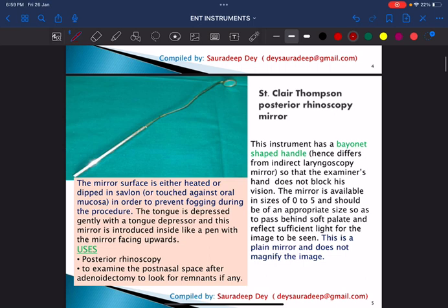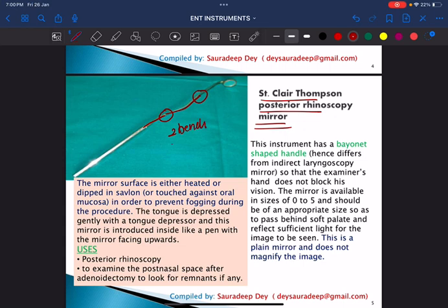Next is the St. Clair Thompson posterior rhinoscopy mirror. For anterior rhinoscopy we use the Thudichum nasal speculum; for posterior rhinoscopy we use the St. Clair Thompson posterior rhinoscopy mirror. It has a bayonet-shaped handle with two bends — a first bend and a second bend. This is how you differentiate this posterior rhinoscopy mirror from the indirect laryngoscopy mirror.